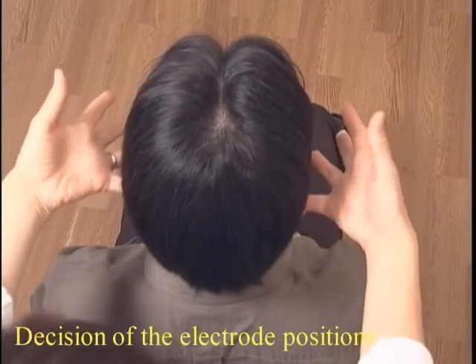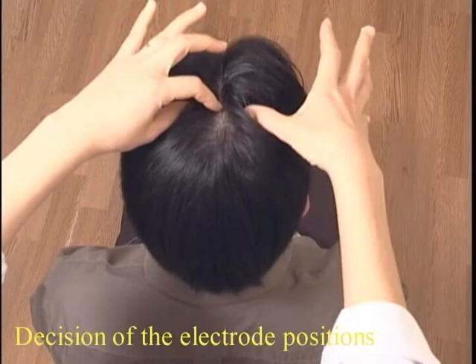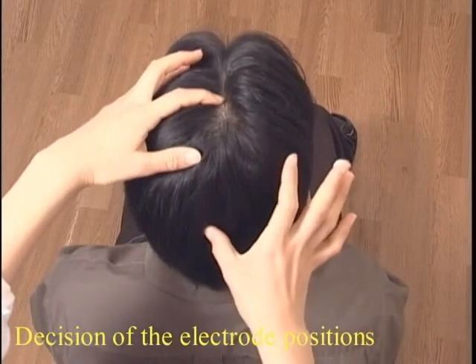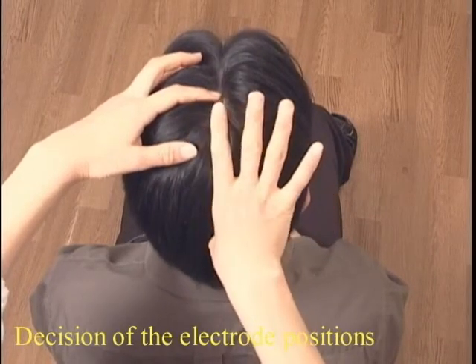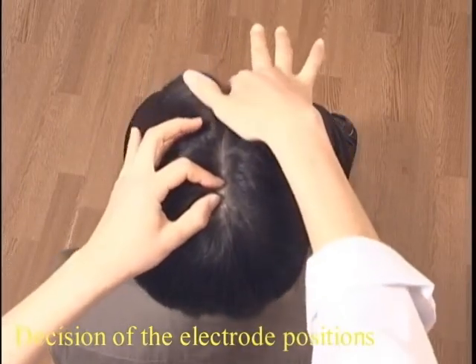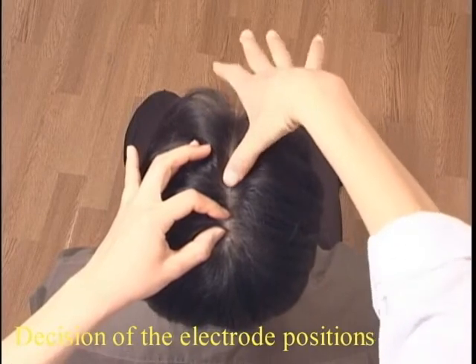From now on, the electrodes will be applied one by one. Put the subject in a sitting position. That will make electrode placement easier. There is no need to use a tape measure to decide the electrode positions. They can be judged by eye using 2 hands, and the electrodes can be set within a short time.